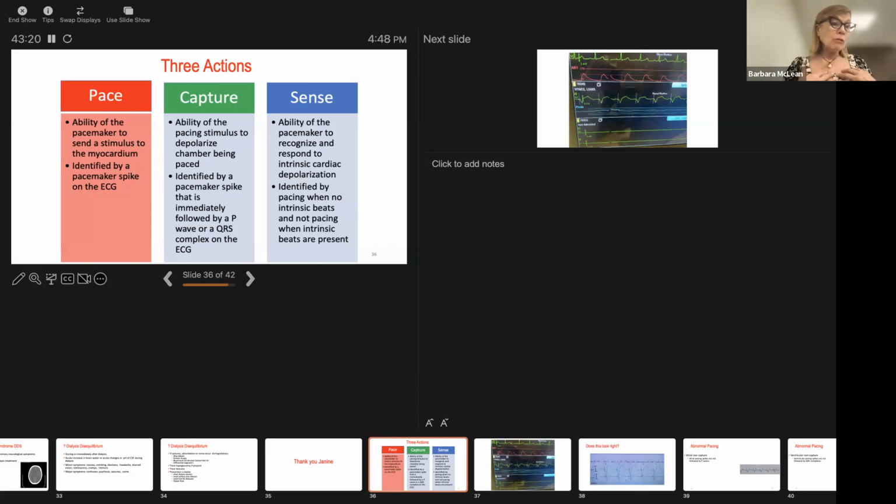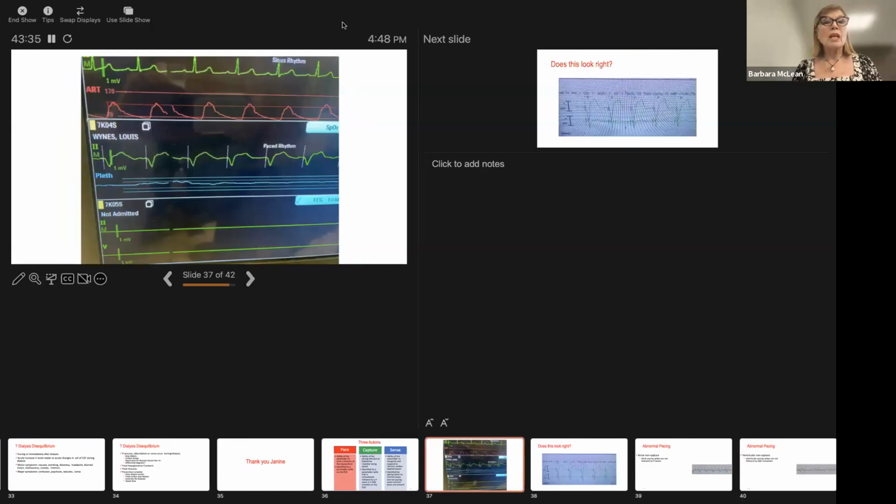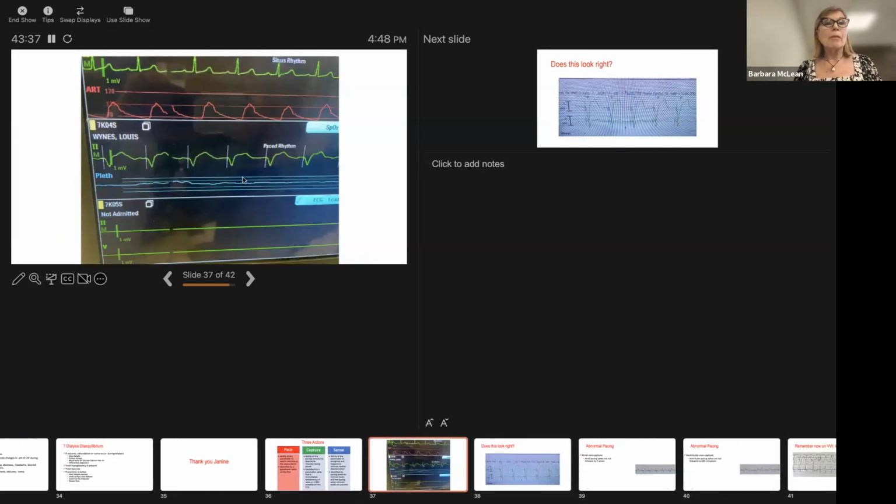Now, when Janine spoke to me, she was uncertain about what was happening with the pacemaker, and lots of fantastic colleagues around actually looked up and said, oh, look, he was on a DDDR and then he got switched to a VVI. Okay, so now we're just going to take a look at his EKG strip on the monitor, and you can see here's his ventricular spike, followed by capture, spike, followed by capture, and this is V pacing. Okay, so that was VVI.